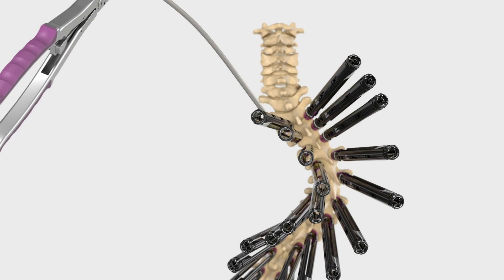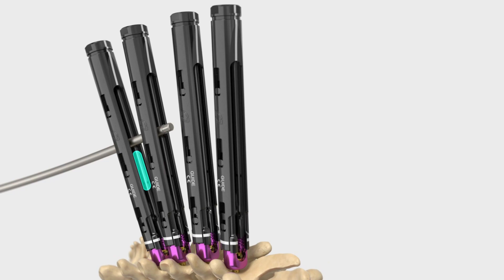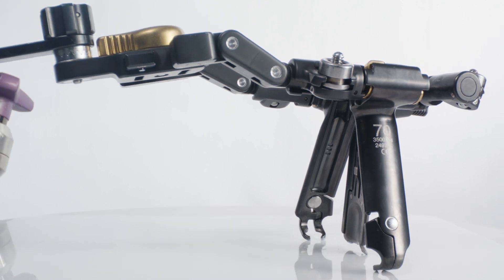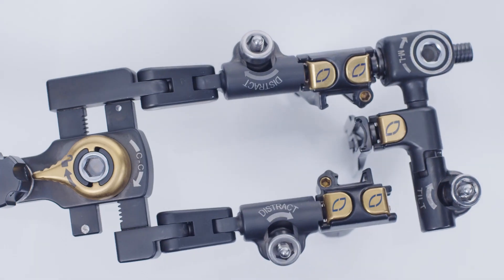The biggest thing that Reline helps you with as far as workflow is that you can use a single tower to do multiple steps. The ability to do prone surgery, prone T lift, and a prone X lift without changing the position of the patient has completely changed my practice.